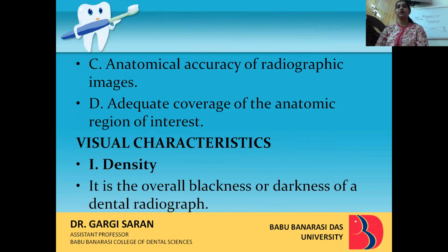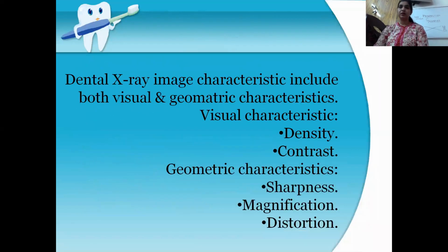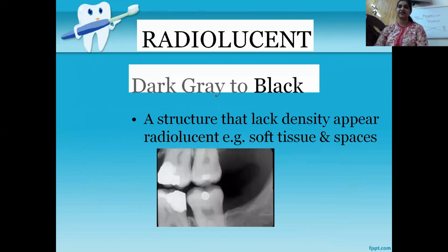Now we will learn about the image quality through visual characteristics, that is density. Density is the overall blackness or darkness of a dental radiograph. Dental X-ray image characteristics include both visual and geometric characteristics.